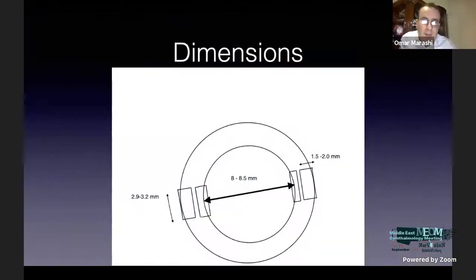This is how he went. He started with the peripheral cuts, then he went to the medial cuts. I'm sorry, the medial cuts. They start from the host and end up in the anterior chamber through the recipient cornea.